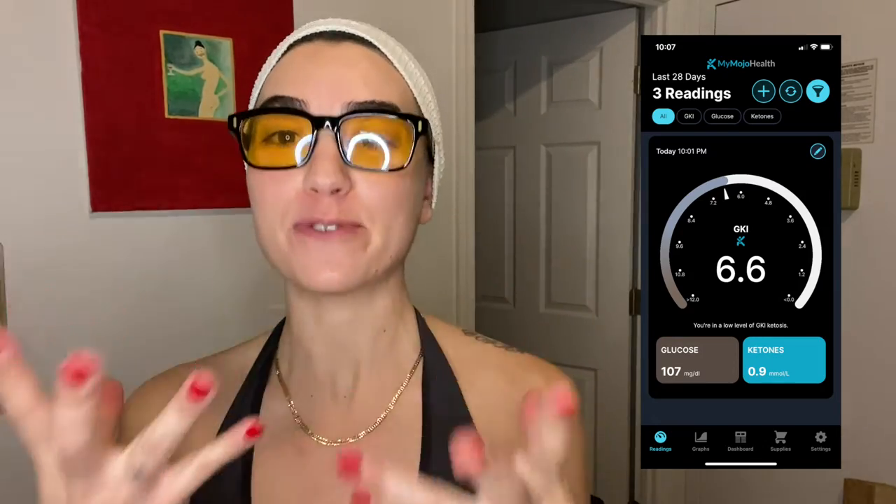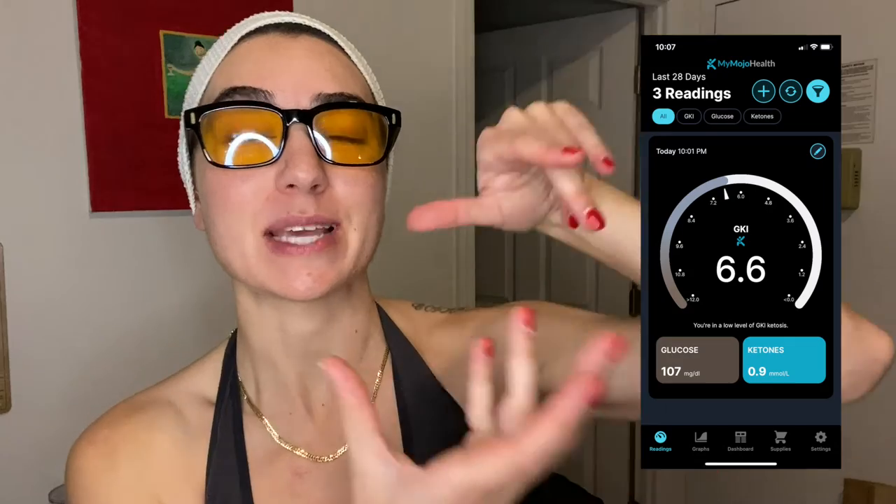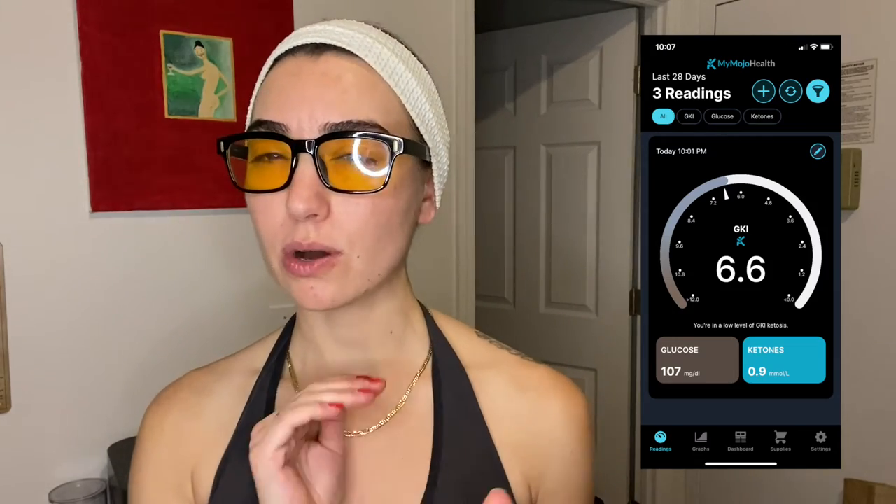I'm inserting a screenshot of what the app is showing me — I record with my phone so I can't show you my phone since I'm using it to record. I am at a 6.6 for my GKI, which would be a low level of ketosis. I would like to lower that number, but that's where I'm at right now. However, I am 0.9 with ketones which is pretty good. I think maybe my sugar is a little high and that's why my GKI is a bit higher than I'd like, but not at a terrible place.